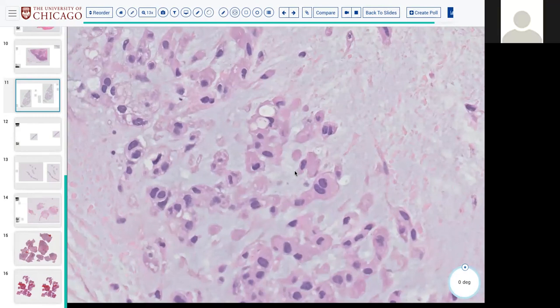Chordoma, I think it is, I don't remember. I just remember brachyury will be positive. Okay, so the brachyury is definitely the most specific immunomarker, which is nuclear and of notochordal origin. We unfortunately don't have brachyury because we don't have that many chordomas, but institutions that are chordoma centers tend to have brachyury. So ours would be a send out to Mayo, but yes, definitely you can do brachyury.